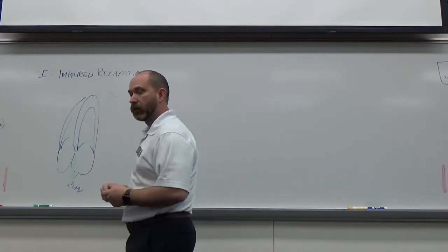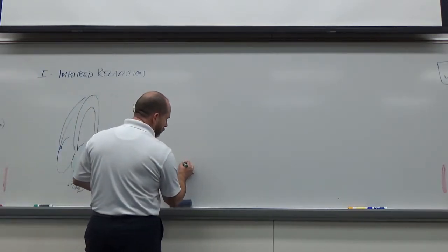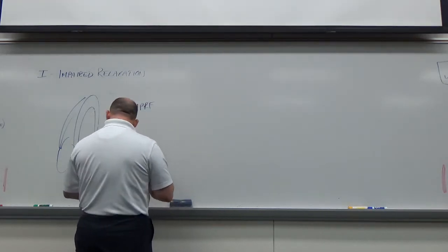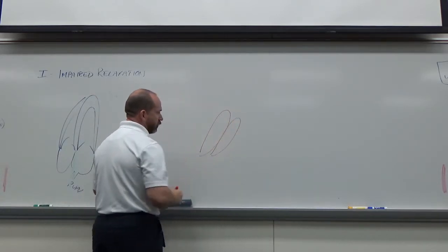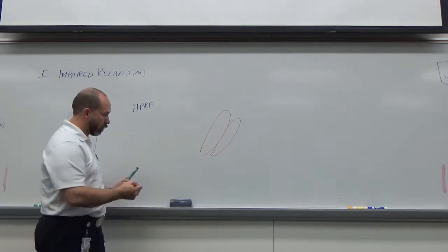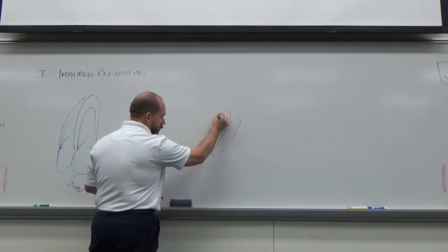So first of all, have we diagnosed that this is impaired relaxation? Yeah, right away from our mitral inflow. The other stuff is just adding information, like, yep, it's still that. So in propagation velocity, again, we're seeing a mitral valve open. As soon as it opens, we get our color fill in. Okay, and it kind of draws it out like this. This is just the aliasing velocity that's going around there. And all we're doing, again, is measuring the slope of that.